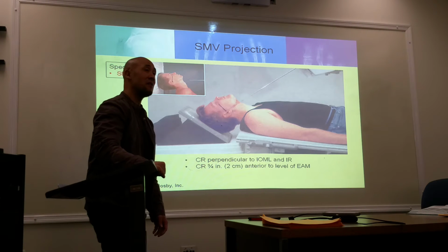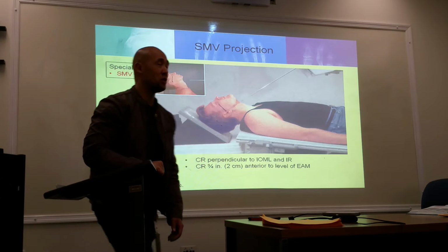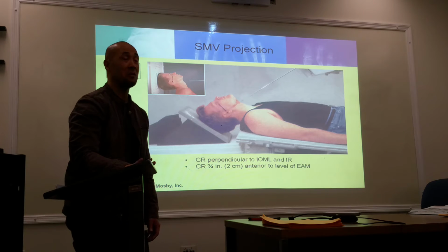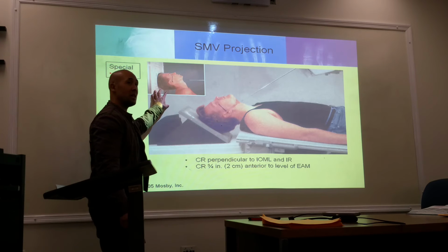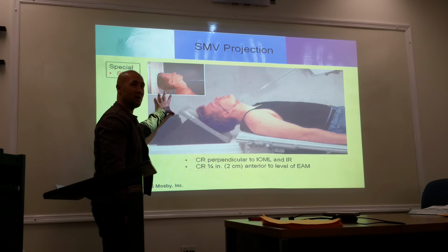So this is a very, very difficult position to do. This is optional, so listen to your department and find out if this is something that is done. But believe it or not, it is a common position that we do in radiology. You can't take your time, because they're not going to hold that position for you. So you need to get through this. This is even harder to do than an enema tip in the rectum for a barium enema.